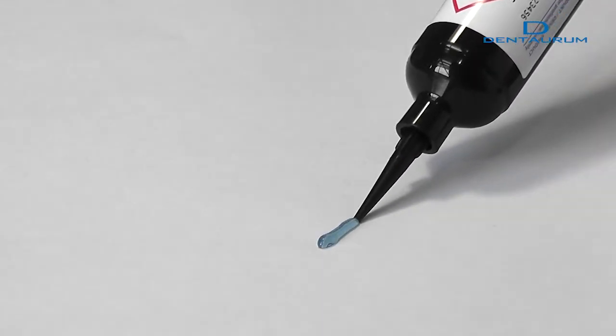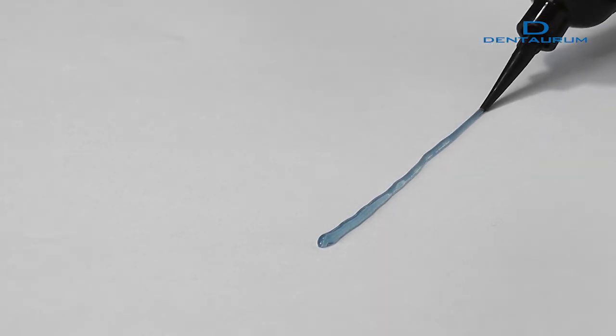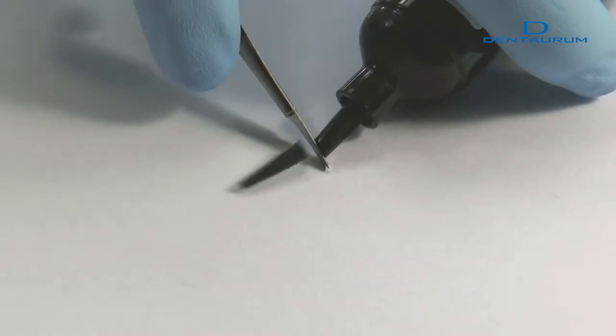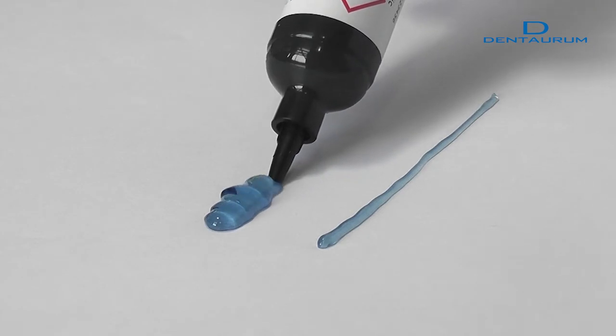The size of the opening of the cartridge tip affects how the acrylic flows from the cartridge. A small opening allows the acrylic to be applied at selected points, whereas acrylic applied through a larger opening will cover bigger areas.